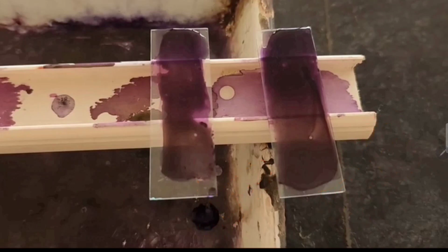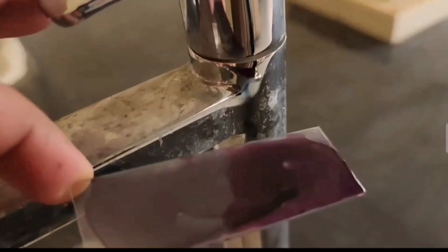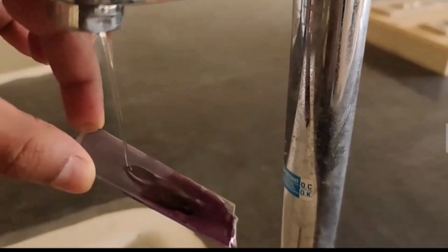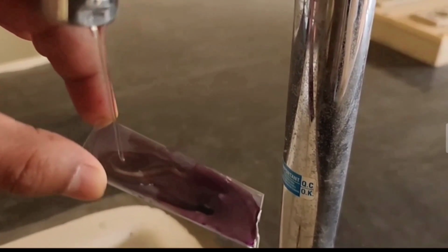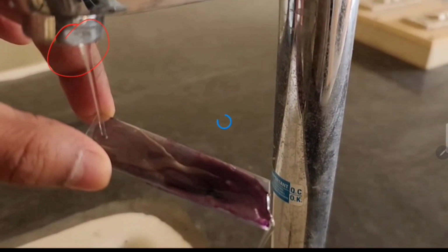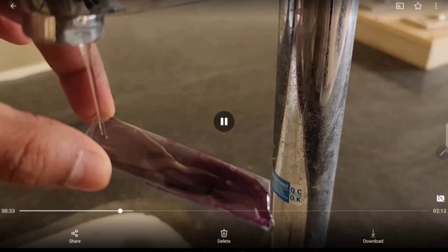Let me show you how. The time is over. So first discard this fluid. As 10 minutes is over, we should discard the extra fluid, and then we should wash it under tap water. So I am taking it under the tap and opening the tap slowly. Open the tap, a few drops, yes, and then we can wash it here. We should keep our slide like this under the tap. Just open it slightly and then allow water to fall here, and it will go through this area to wash it until the appearance of a light pink color.